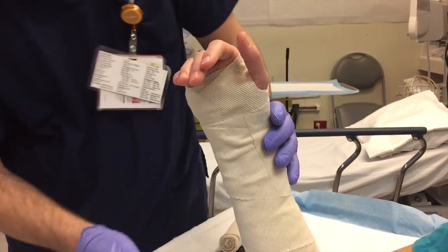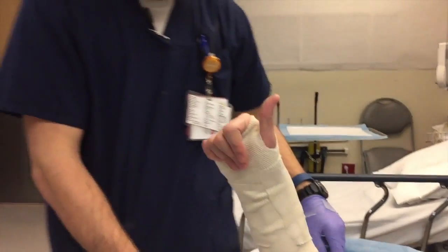All right, looks beautiful. And lastly, with any splint, whether it's an upper or lower extremity, just make sure after the splint application, you check with the doctor and make sure the angle's all right. The doctor will give the final seal of approval saying, yep, that's a good looking splint, and give the discharge order. So please make sure you check with the doctor prior to discharge.